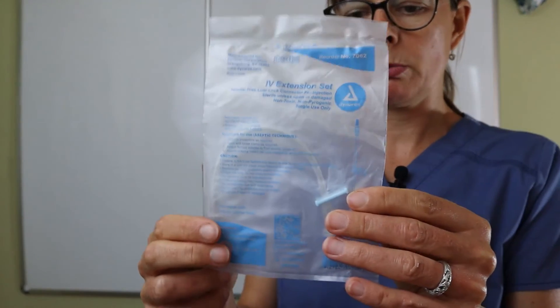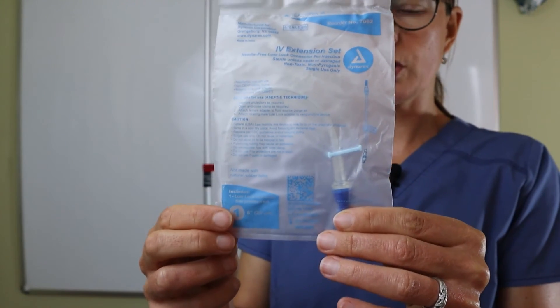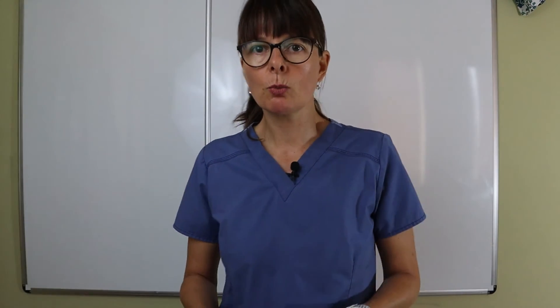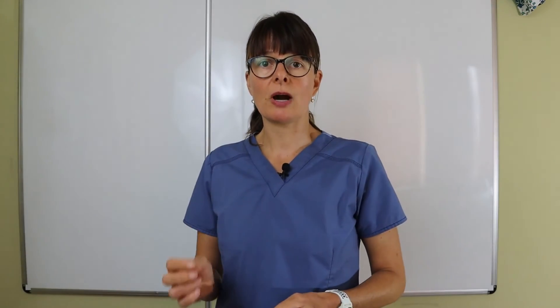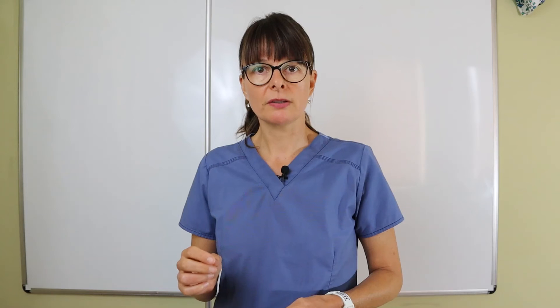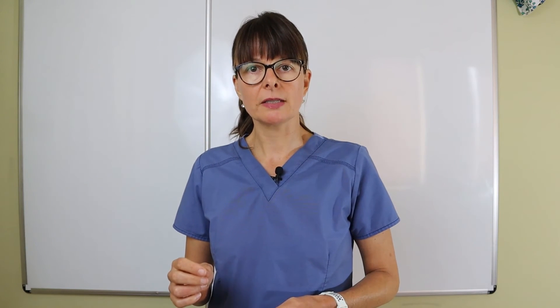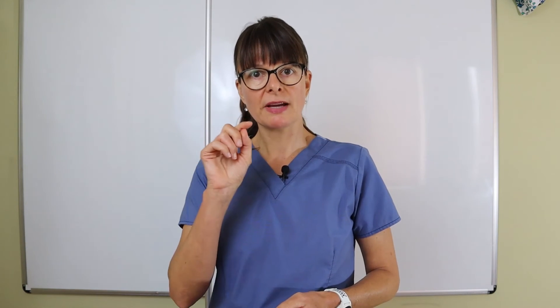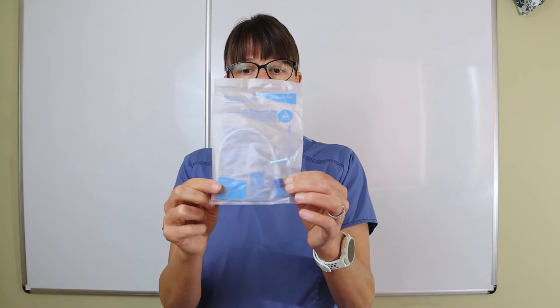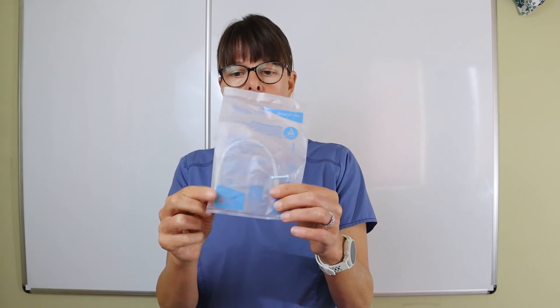The other type of tubing I have pulled out here is IV extension tubing, and this is just a very short tubing. It depends on what kind of IV access or IV catheters the facility you're working at is using. Many times the IV catheter already has this IV tubing attached to it, so you don't have to worry about it. But if it's just a needle as well as the catheter, then you need to hook it up to something, and this IV extension tubing will work for that.